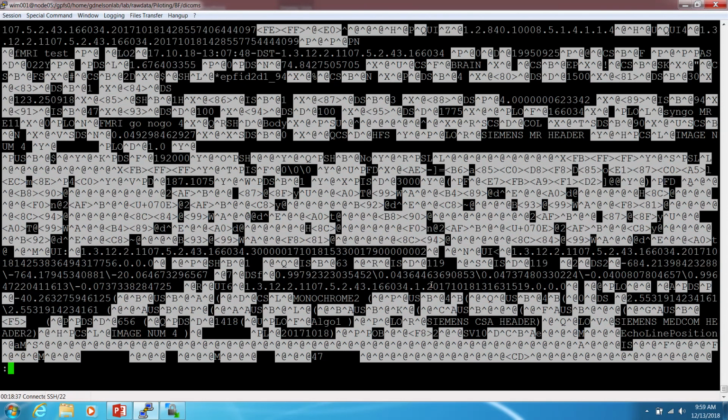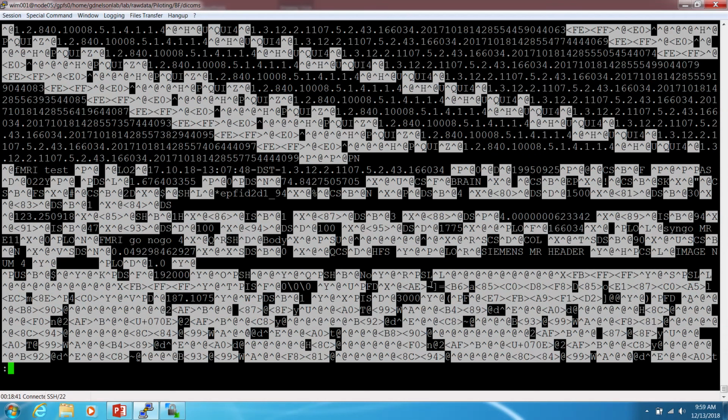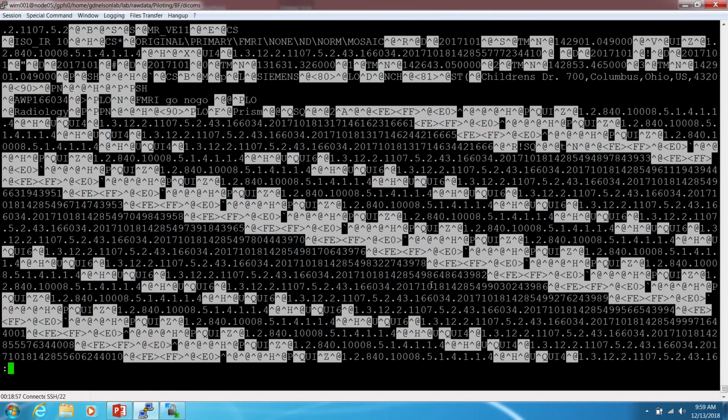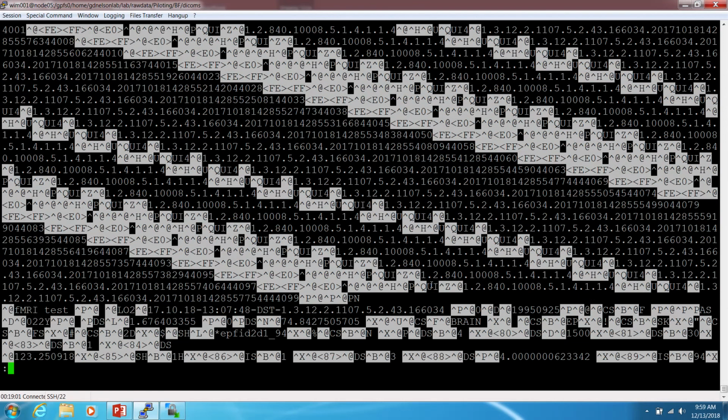The problem from the identification point of view is that in here, if there's patient information, there's raw text that would say, oh, this is Whitney Matson, and he was born on this date, and sometimes he even lives here. So we want to make sure to not store any of that. Fortunately, if we anonymize, that all gets scrubbed in here.